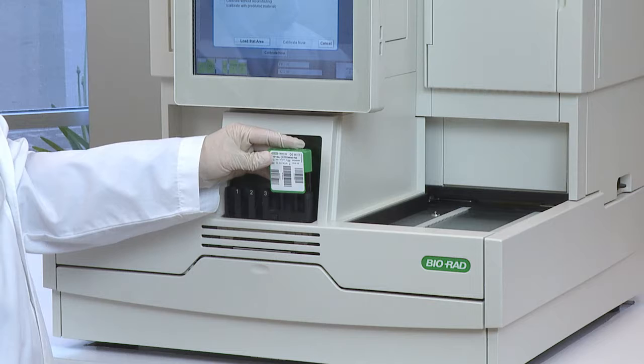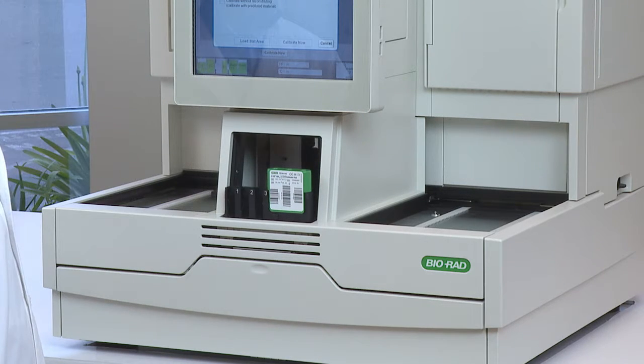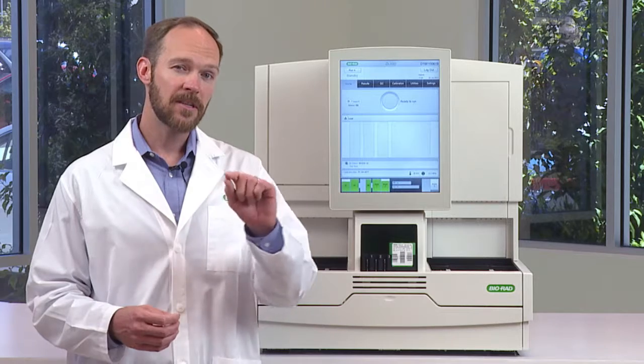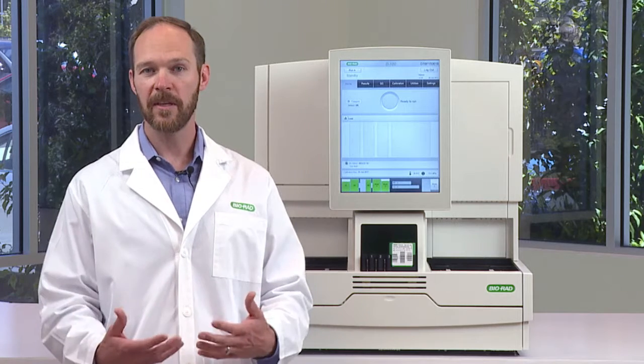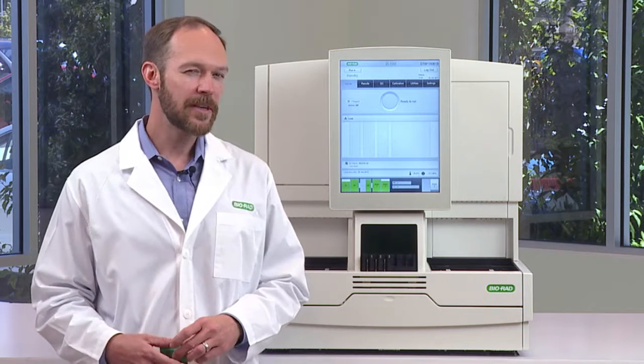All you have to do is load the calibrator pack on the stat area and touch Load on the screen. The system will read the barcodes, and then all the operator has to do is touch Calibrate Now, and it will begin the calibration process automatically. These are things you don't have to do very often.